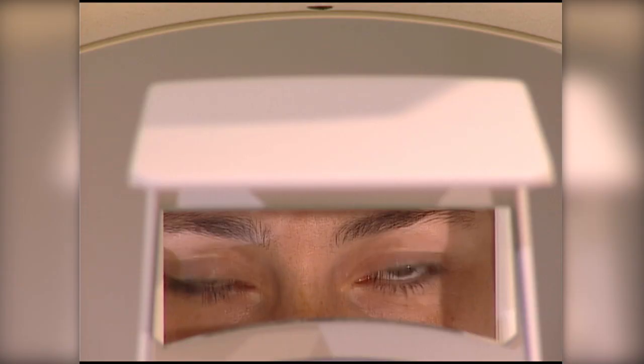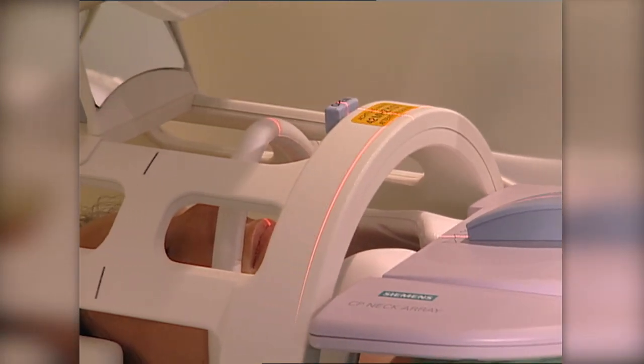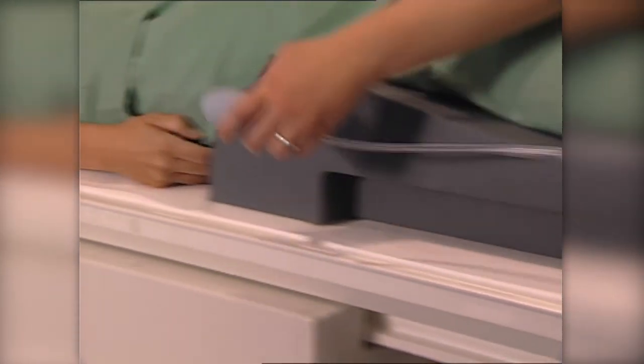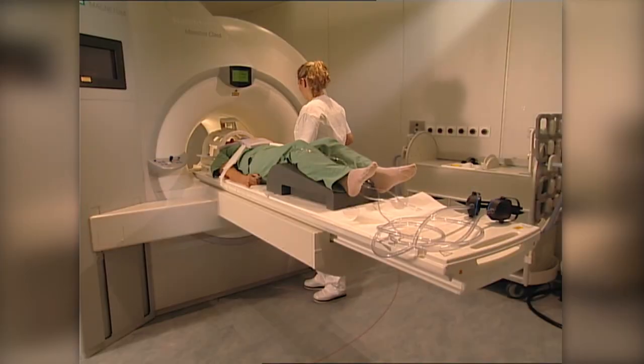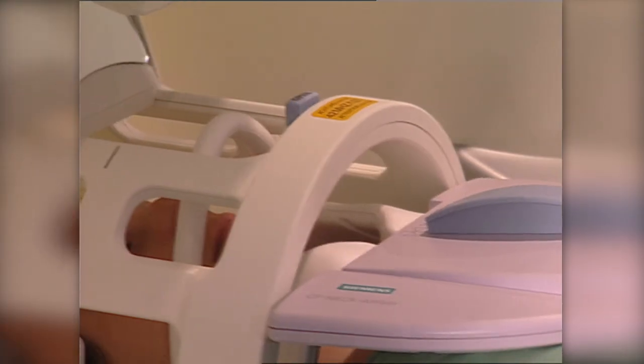While positioning the laser-like localizer, patients must keep their eyes closed. Patients receive a squeeze bulb to hold. They can call for help anytime by pressing the ball. The exam can be interrupted immediately. Make sure that clothing and coils do not hang over the patient table.